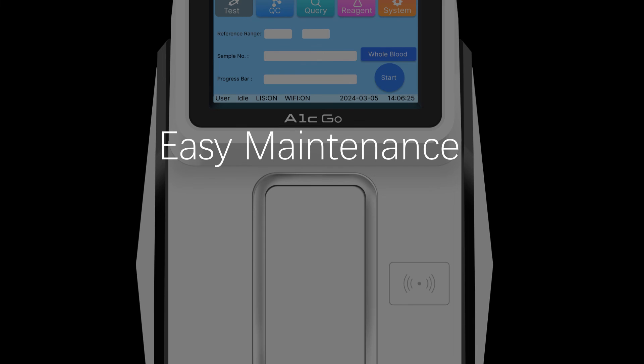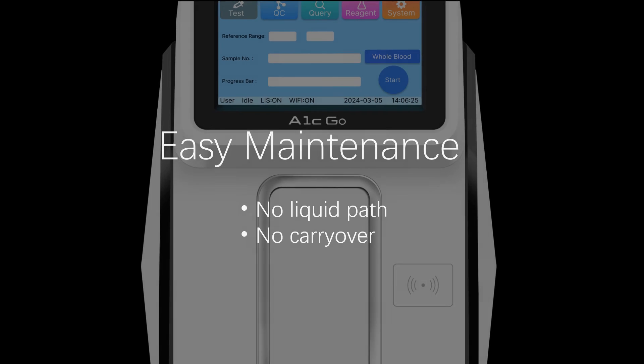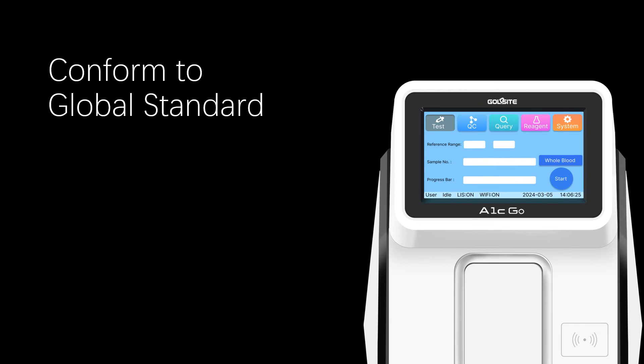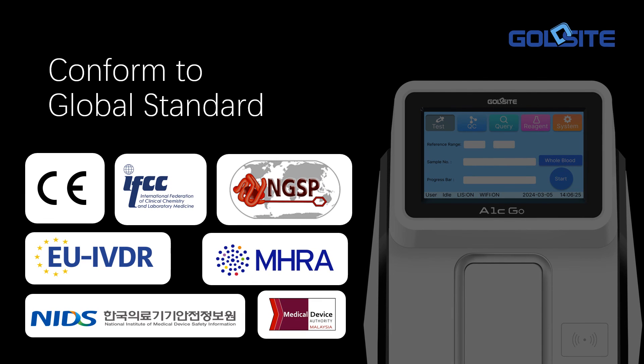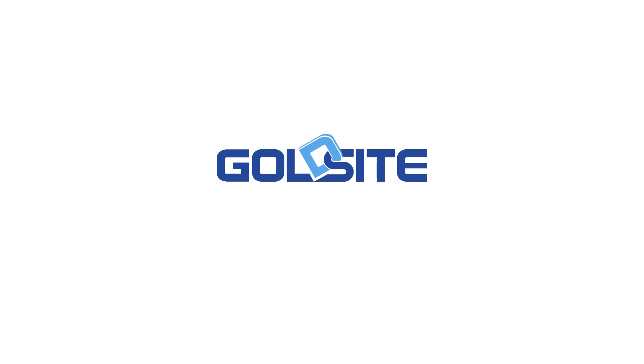No liquid path. No carryover. This means easier daily maintenance, conforming to global standards. Goldsite — your path to accurate diagnostics.